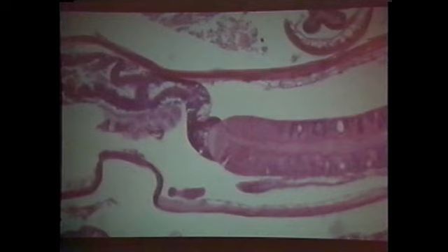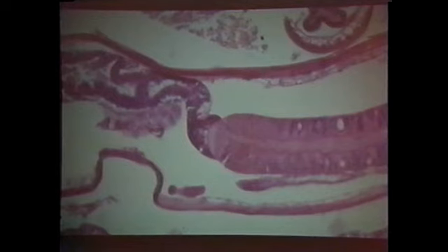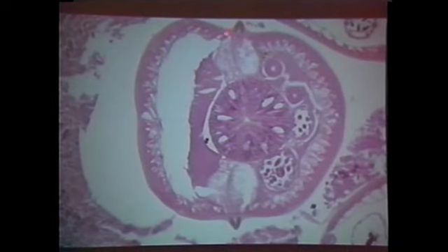The esophagus gives rise to the intestine, right here. This is the esophageal-intestinal junction. And the esophagus, usually in most nematodes, will be triradiate. What is triradiate? That's triradiate. And the cuticle from the outside comes down into the inside and lines the esophagus. So you can tell this is in the area of the esophagus. Hopefully you people are now looking at structures that we've talked about: cute little lateral alae, huh? Coelomyarian musculature.